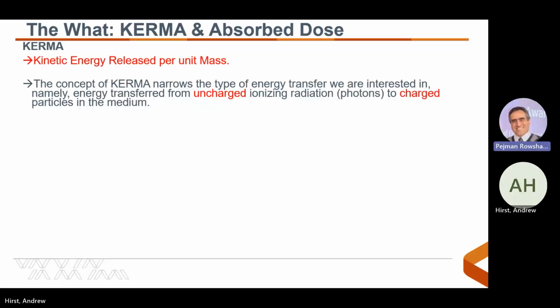And just a caveat, we're limiting this conversation to photons and not electrons, because you can treat with other modalities like protons and whatnot, but we're only talking about photons and how those photons deliver energy to charged particles in our medium of interest.